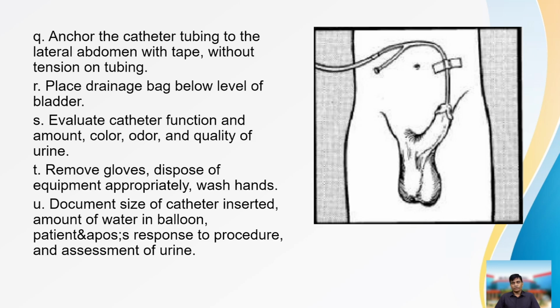Next, evaluate catheter function and the amount, color, odor, and quality of the urine. Remove gloves, dispose of equipment appropriately, wash hands, and document the size of the catheter inserted, the amount of water in the balloon, the patient's response to the procedure, and assessment of the urine.